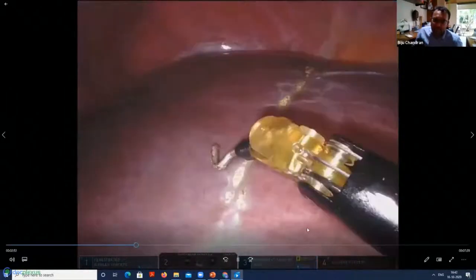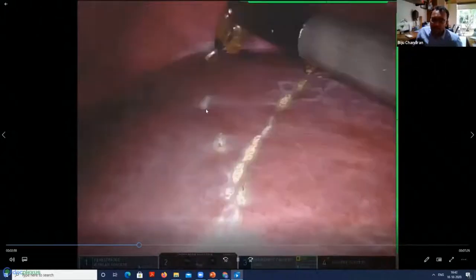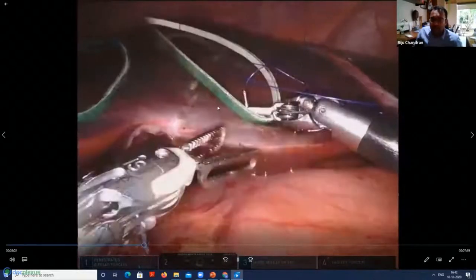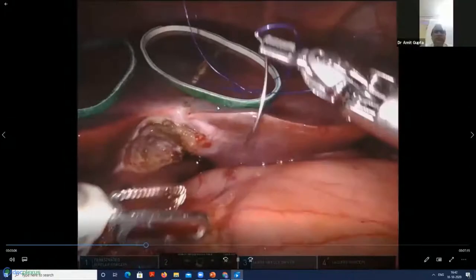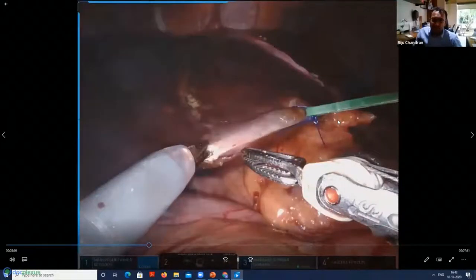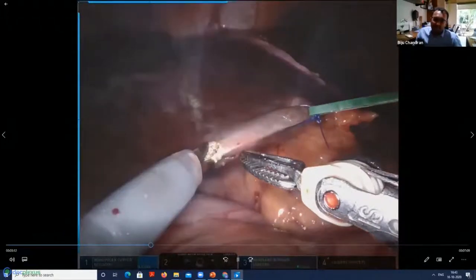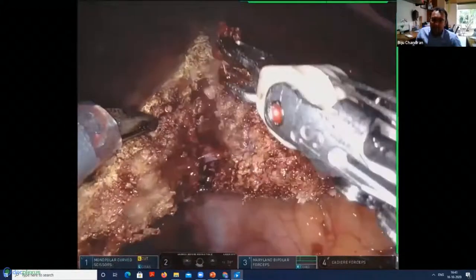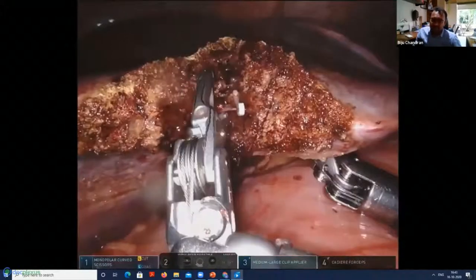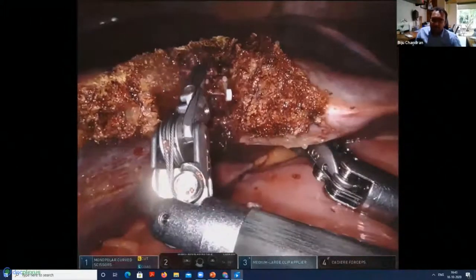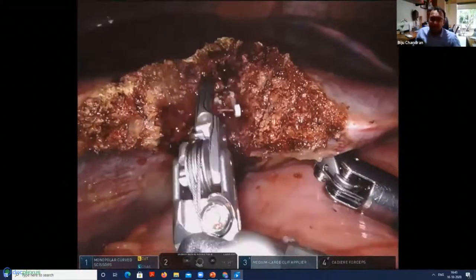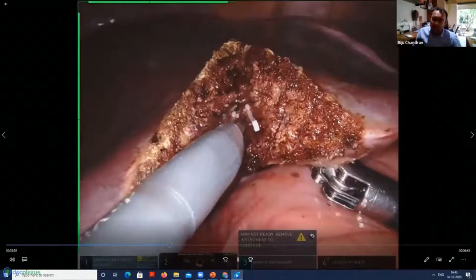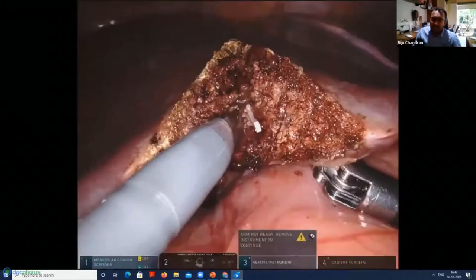The right hepatic artery and the right portal vein are clamped, with the duct on top and the cystic duct retracted toward the left shoulder. A gentle dissection shows the line of transection. The demarcation is much lateral, but we go directly from the gallbladder fossa to the groove — this is the actual discoloration line, but we don't follow it entirely as it increases parenchymal transection time. We use the rubber band retraction technique for stable retraction. Since there's no CUSA on robotics, we use robotoclasia — the Kelly clasia — to crush the parenchyma, leaving the veins behind. We identify a nice segment 4b vein marking the start of the middle hepatic vein, staying to the left and dividing with hemlock. If hemlock is insufficient, use double hemlock or hemlock with a metal clip.